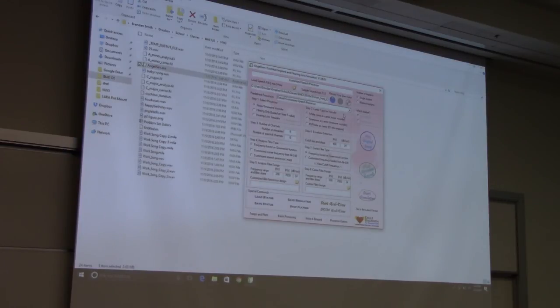The problem is, in music, you don't just have 1,000 to 2,000. You have like 440 hertz is one note. You go up to maybe just 490, you're hitting another note. You need much better discrimination. So what we can do with cochlear implants, theoretically, is maybe we're not going to get the amount of discrimination the human ear has, but maybe we could at least hit the frequencies that we're looking for.